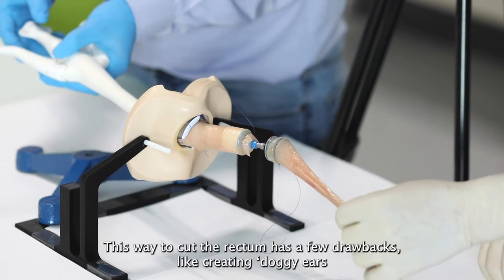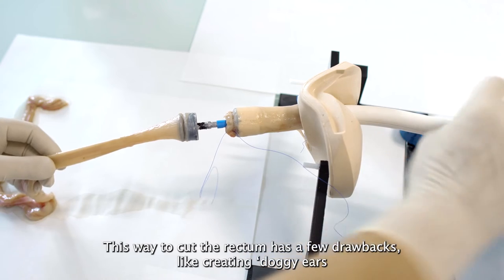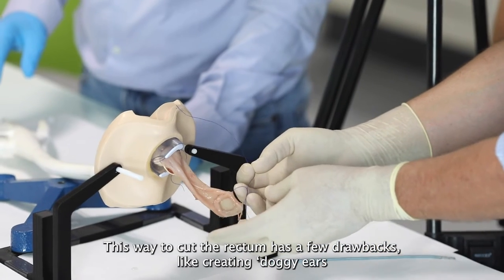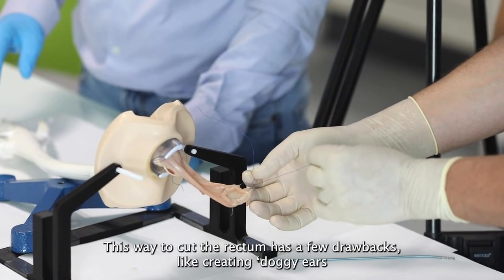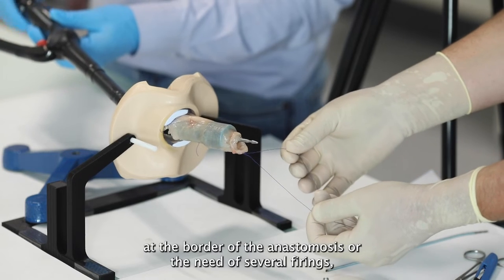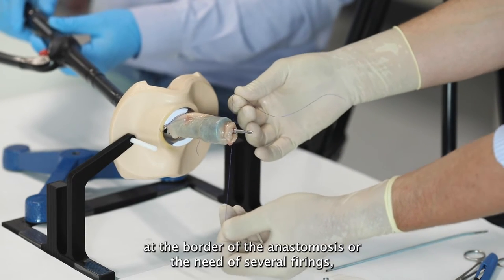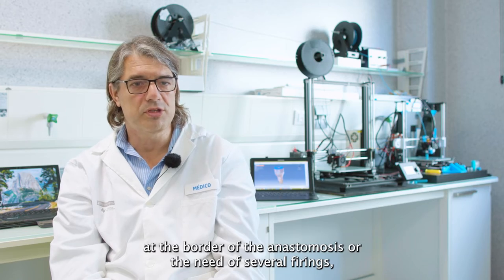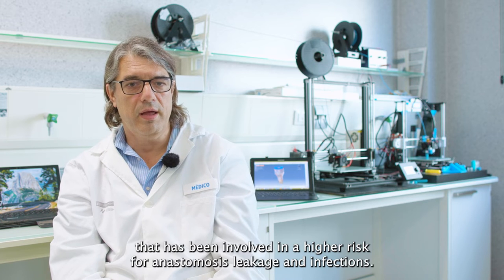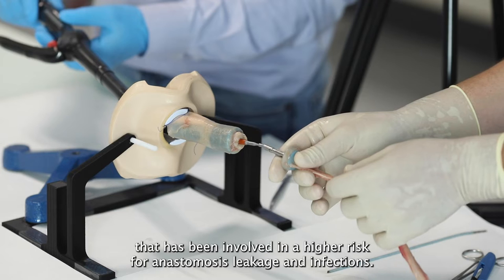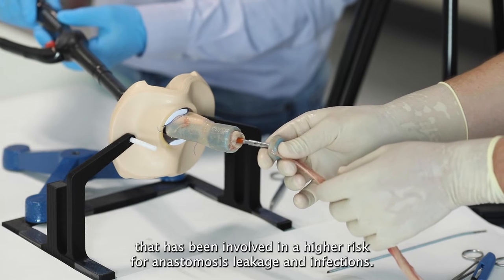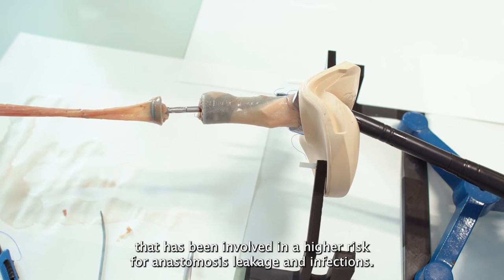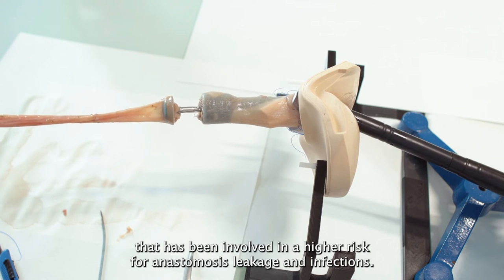This way to cut the rectum has a few drawbacks, like creating dog ears at the border of the anastomosis, or the need for several firings that has been involved in a higher risk for anastomotic leaks and infection.